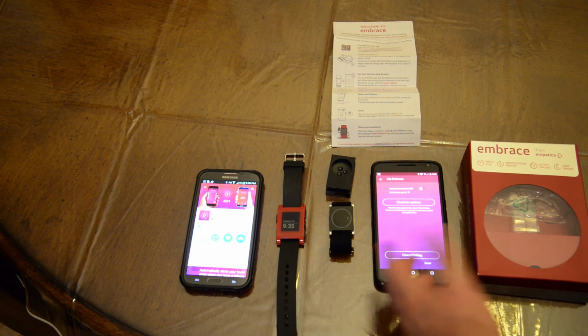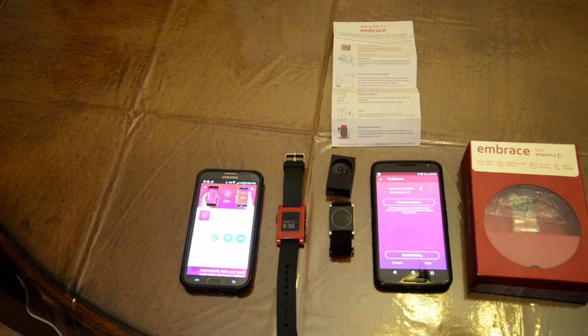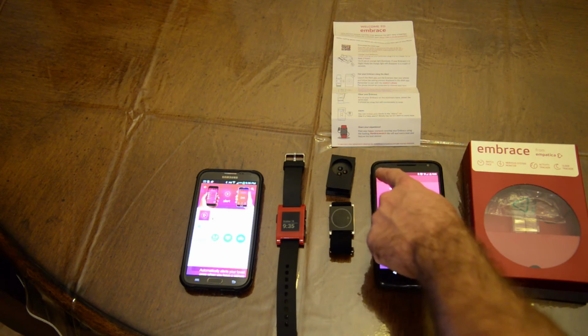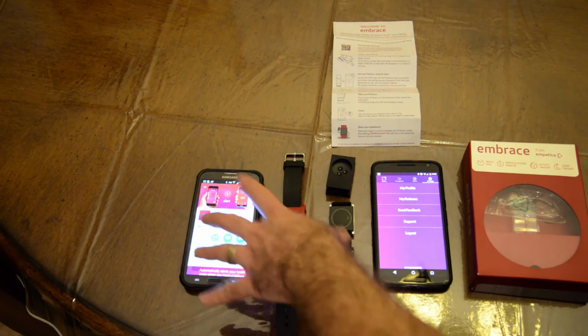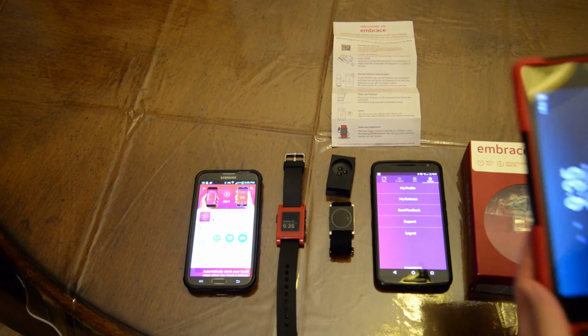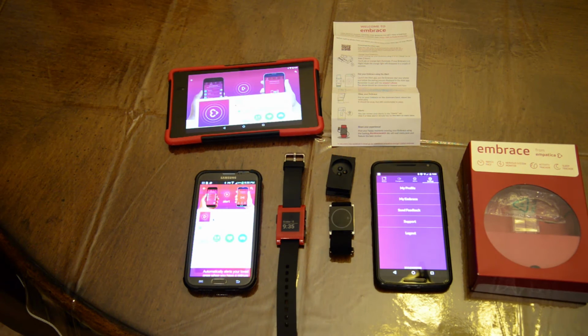This is important because it is a beta. It is important to understand. Technically, Open Seizure Detector is also a beta. It's open source, so the software is getting better over time, just like this one. So hopefully in the future, it will support older phones as well as a tablet. I have a Nexus 7, and this would be a great device right here to use. Unfortunately, it's not compatible with a tablet either.